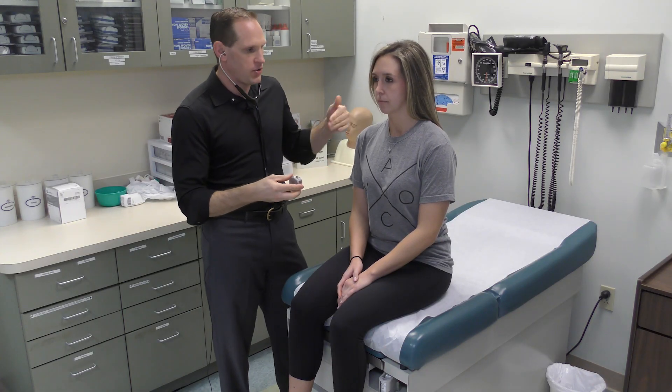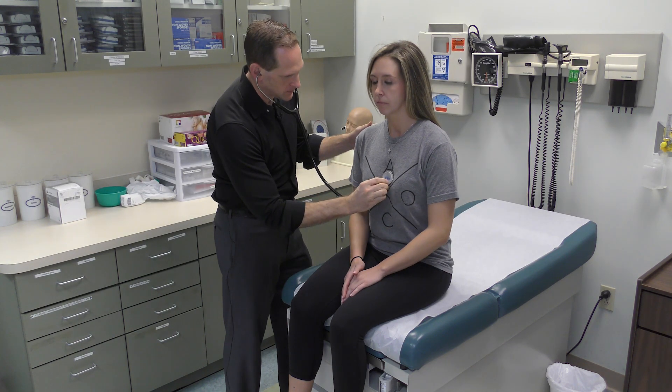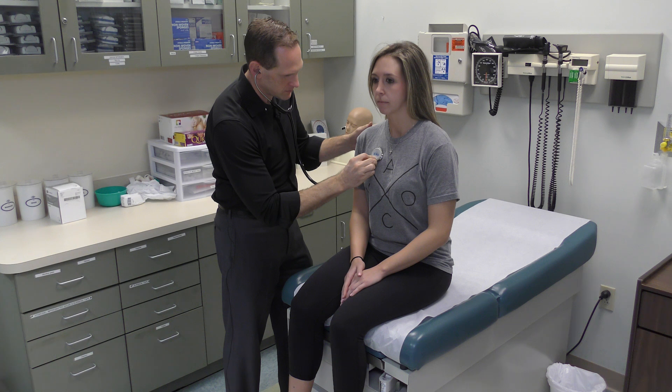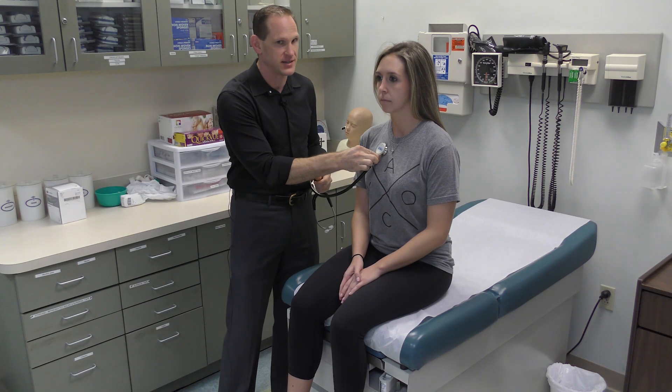Once you've listened all the way down with the diaphragm, we're going to turn it over, use the bell, and go back up. When you use the bell, you want to use very light pressure — with the diaphragm you use firm pressure, but with the bell use very light pressure while maintaining a good seal. It needs to be on the patient's chest but not pressing down. If you press down, it essentially forms a diaphragm, which defeats the purpose of using the bell.